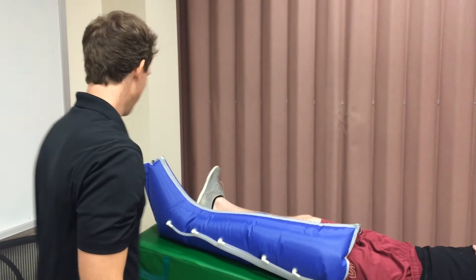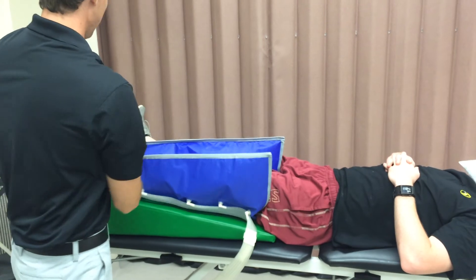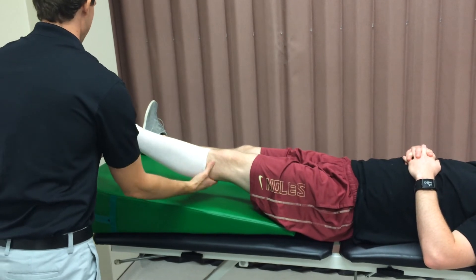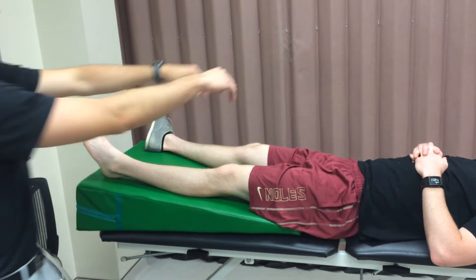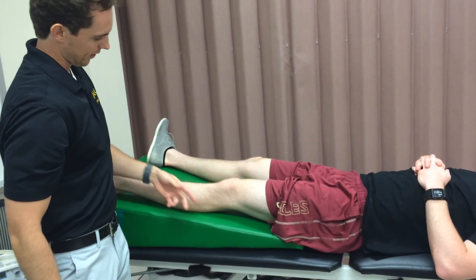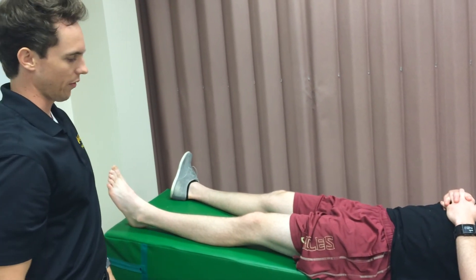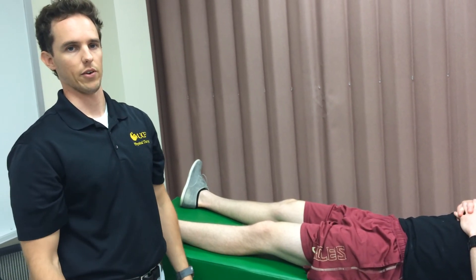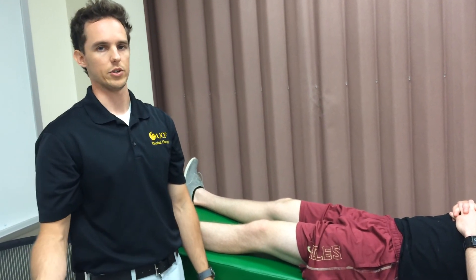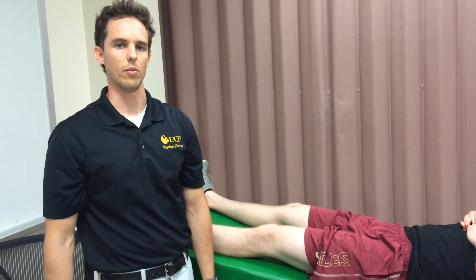Now that treatment is complete at the end of two hours, we're going to turn the machine off, unzip the sleeve, and remove the stockinette. Once we have all that off the patient's leg, we're going to reassess — check for any kind of skin irritation or redness. We're going to re-measure our circumferential measurements taken earlier around the knee and around the ankle, and reassess the patient's blood pressure for any adverse reactions. Expected outcomes for this treatment is to prevent any future deep vein thrombosis in our patient. That basically concludes our modality on intermittent pneumatic compression.